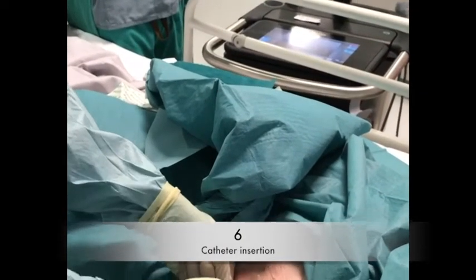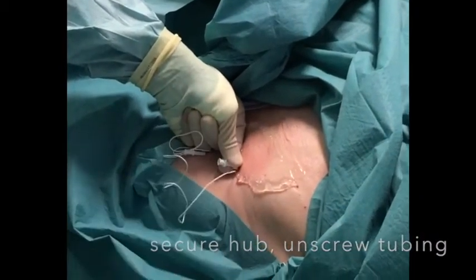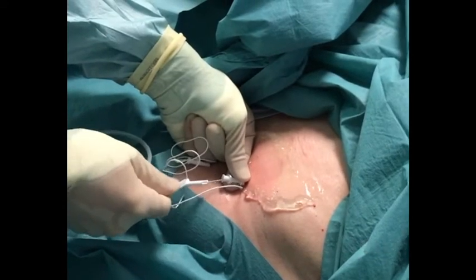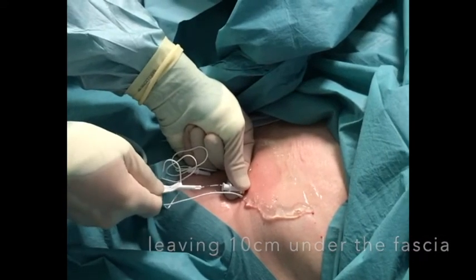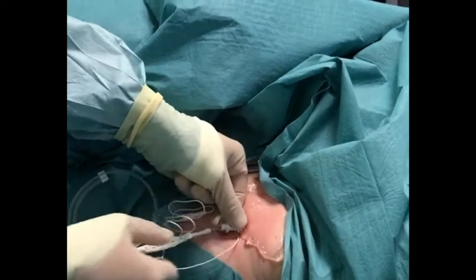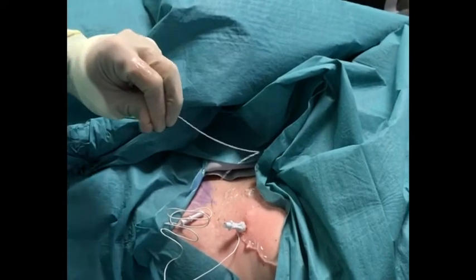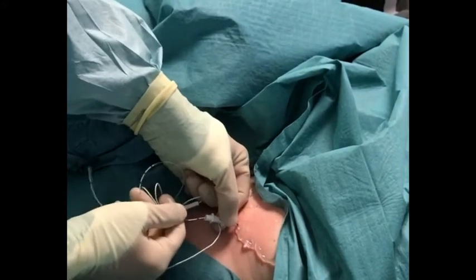Stage 6 is the insertion of the catheter. Secure the needle hub with your hand and disconnect the extension tubing. Take the catheter, which you will have placed somewhere within easy reach, and begin to thread this into the needle. The catheter is marked with single dots at centimetre intervals, by two dots at 10 centimetres, and three dots at 15 centimetres. Aim to leave 10 centimetres under the fascia iliaca; in practice this means the catheter should be somewhere between 10 and 15 centimetres at the skin. If you wish, you can ultrasound the catheter at this stage. Otherwise, remove the wire from within the catheter and then remove the needle, taking care not to allow the catheter to slip out too much.